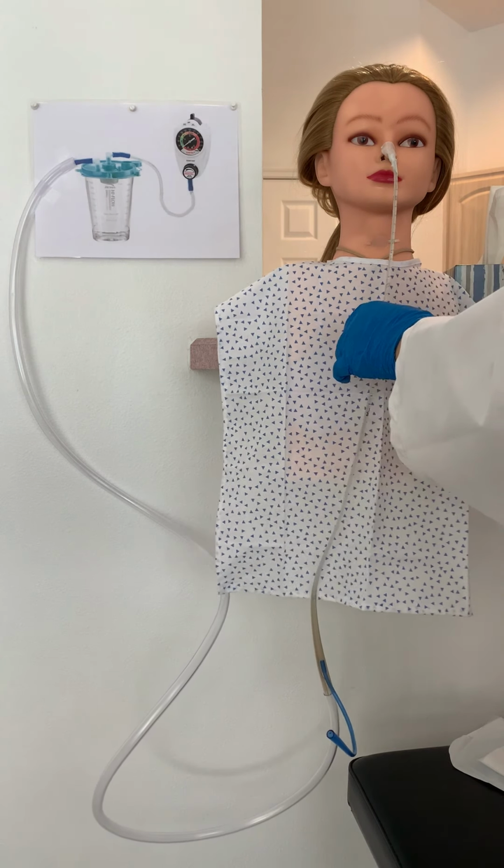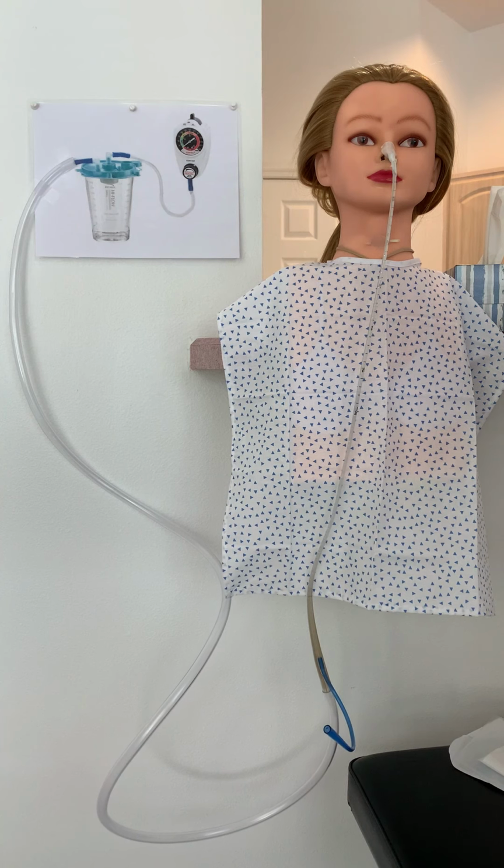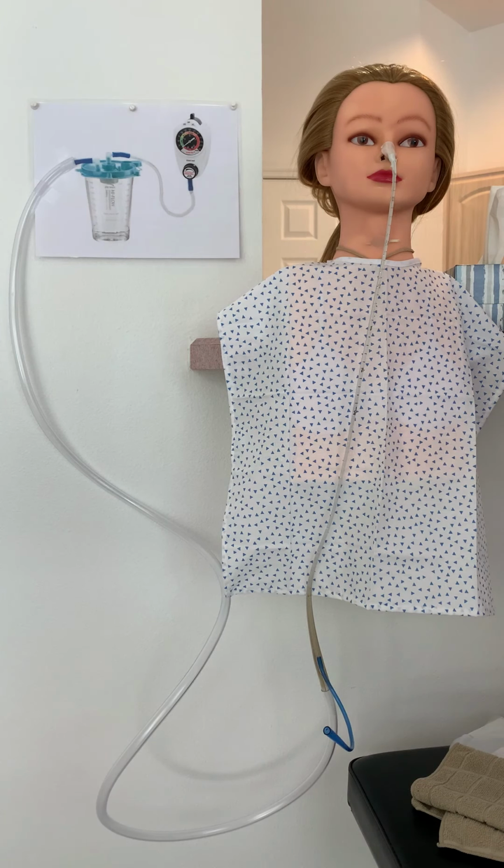So next I'm going to take the towel off, and we're going to just ensure that her tube doesn't get pulled by attaching it to her gown. For this, we will use a rubber band and a safety pin.